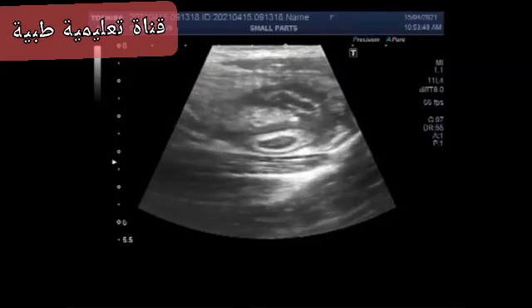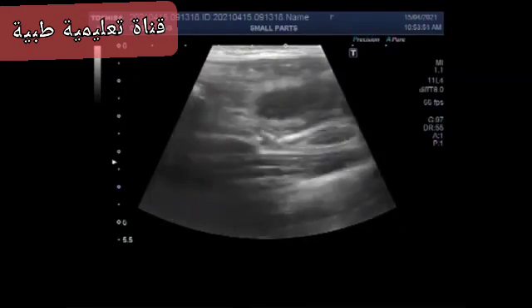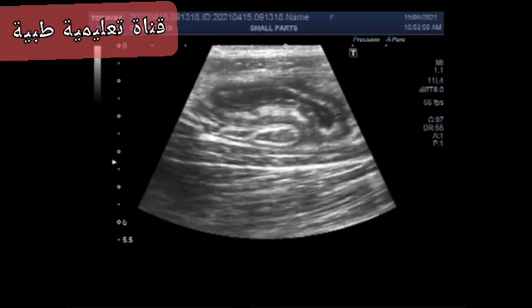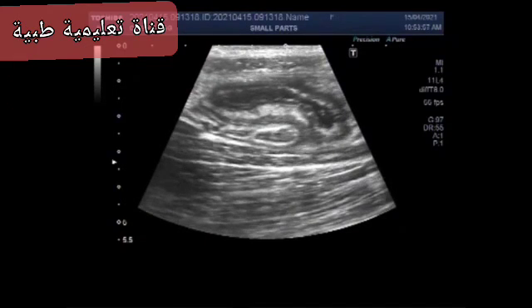Now this is a case where the patient is experiencing severe pain in the right iliac fossa. When acute appendicitis is suspected, you can scan the patient lying supine. I selected a high-frequency transducer, from 7 to 11 megahertz. You may put a pillow under both knees to have the abdomen of the patient relaxed.